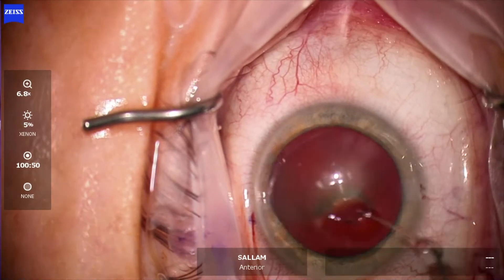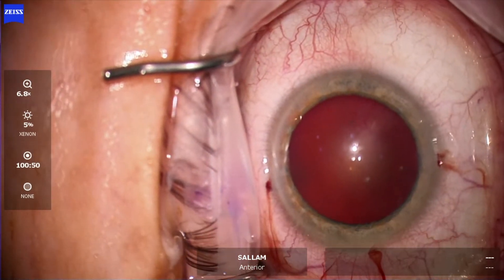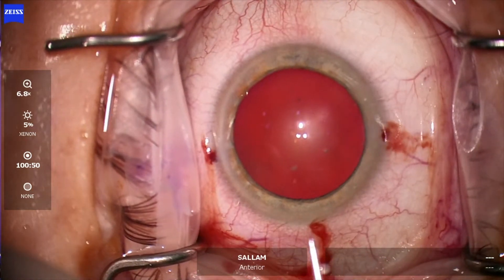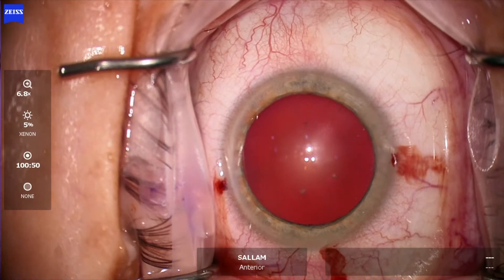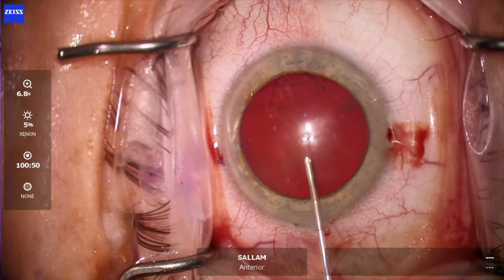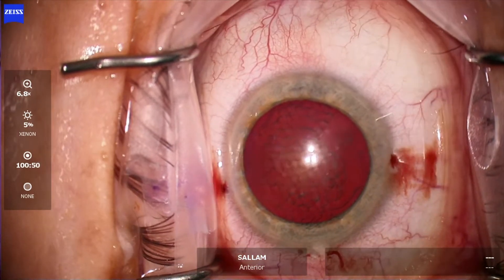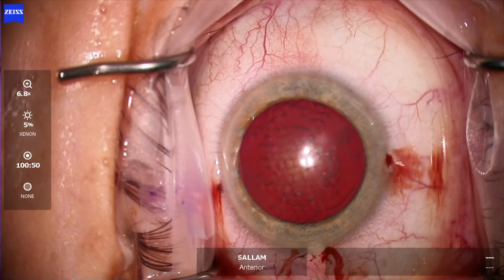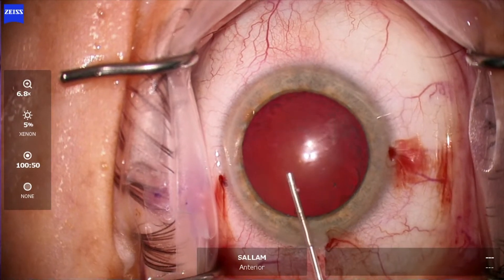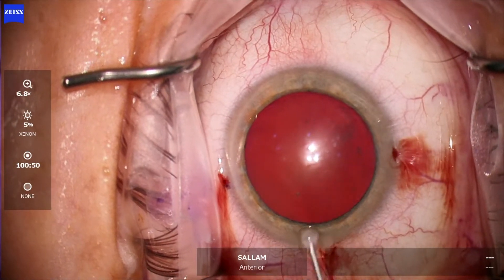At that point it's good to tell the patients that it stings a little bit now. Viscoelastic is coming, and I use Steve Archinoff's shell technique — dispersive viscoelastic first to the cornea, then cohesive viscoelastic underneath to fill the anterior chamber.